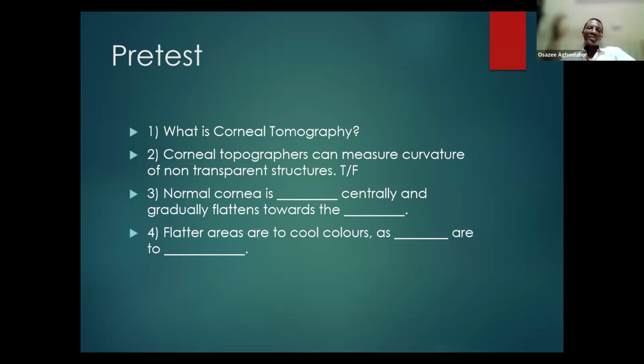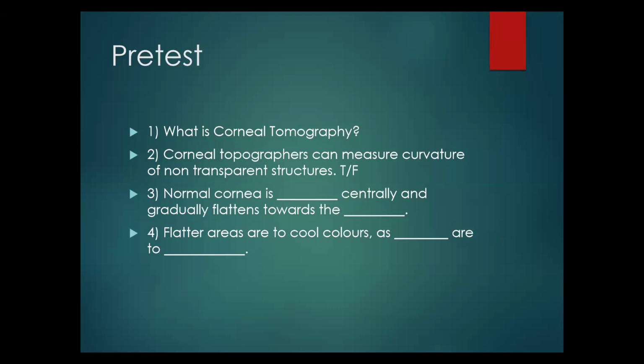Fine, it's fine. As long as you give me the right words, there's no problem. If you give me warm or hot colors and also give me steep. I'm not saying it to suggest I'm so keen on my score, but it's fine, so it doesn't matter if I score 1 or 2. That's not important to me.